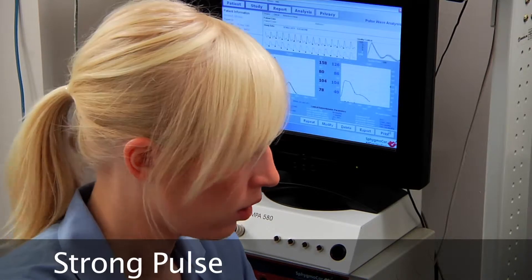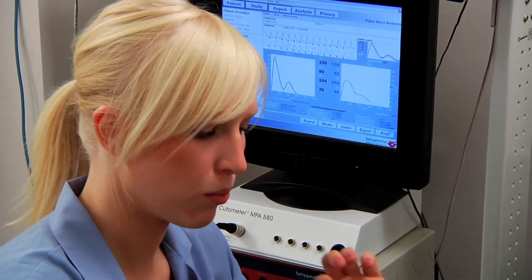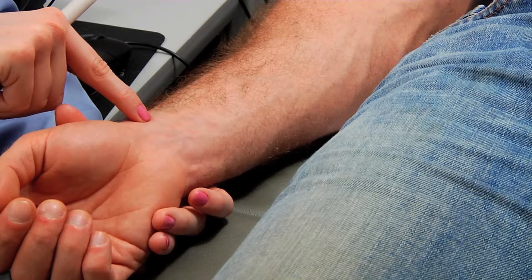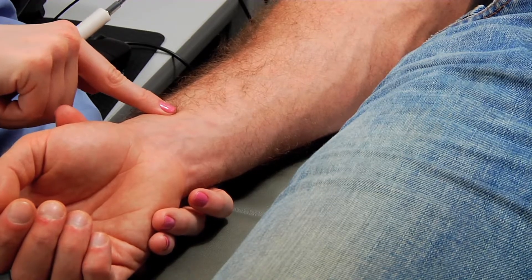Sometimes you'll put your finger on their pulse and it'll be a really bounding pulse, and you'll think it's going to be a really good measurement because the pulse is very easy to find. Those pulses are actually often the worst measurements, because when you place the probe on the pulse, it's so strong that it'll push the probe off the artery and then you can't get a measurement. Instead of placing the probe up close to the joint of the thumb, move down the artery a little bit further where it's more embedded and not quite as strong.